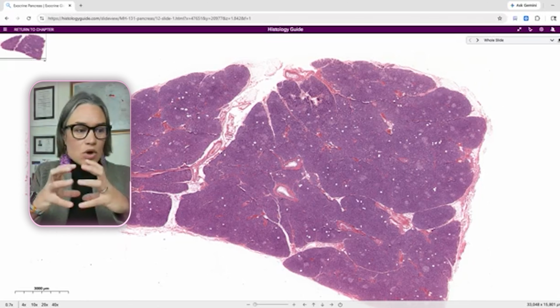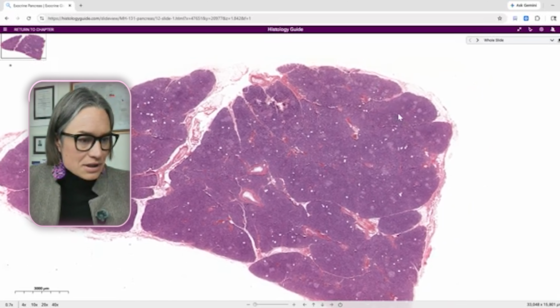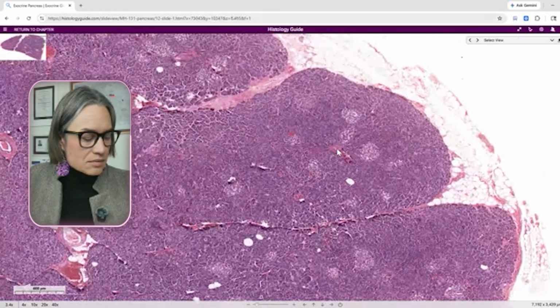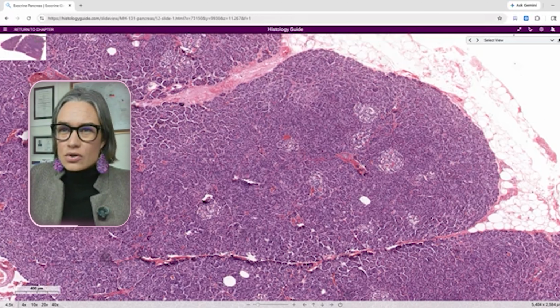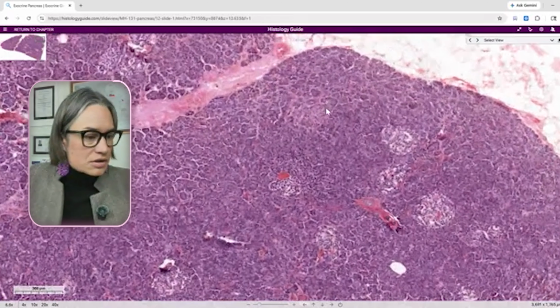A bunch of small, I don't know what other word to use. Lobule is the word to use, but let's call them assemblies. If you have a better word, let me know in the comments. Here is this assembly of cells, right? Let's have a look at it, and we're gonna find these different types of cells in it. I'm going kind of slow so that it doesn't lag for you. And then in the lobes, we have lobules, and lobules are like smaller lobes.